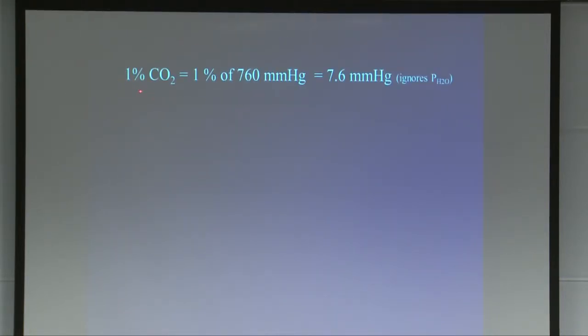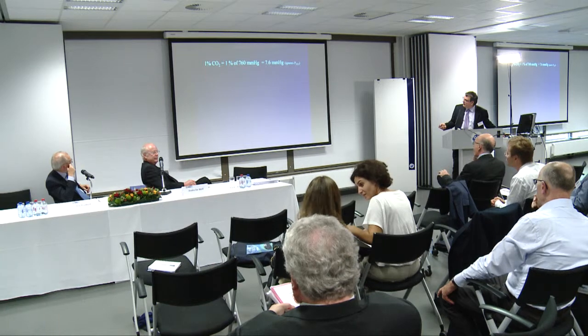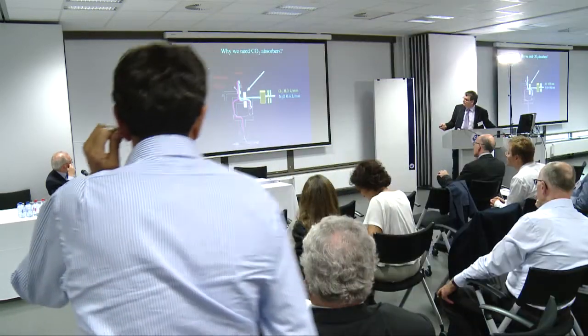Just a reminder, 1% CO2 is 1% of 760 millimeters of mercury. So some anesthesiologists use the percentage display on their screen if they look at the capnogram. Others use millimeters of mercury.